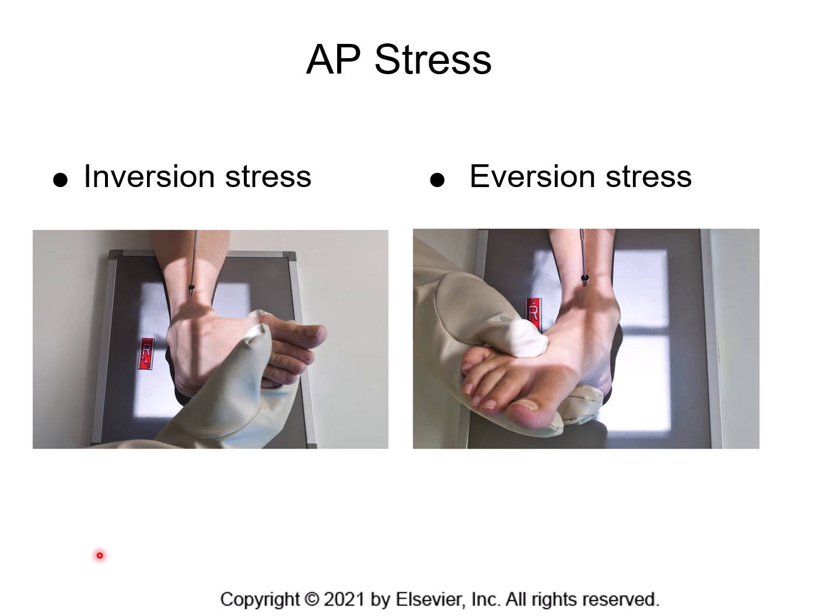So there is someone in there holding the foot and stressing that ankle: inversion stress, take an x-ray, and then do eversion stress and take another x-ray. But the person is holding the foot and putting the stress on the ankle during the exposure.